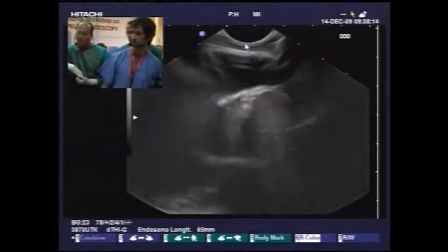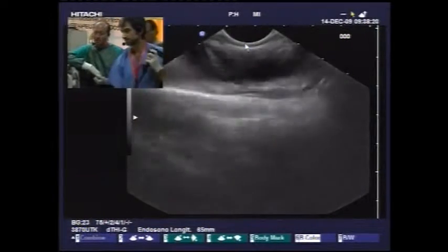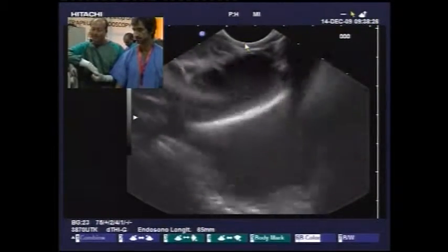With the pancreatic papillotomy? Even with the pancreatic papillotomy, it will get blocked because it's a very thick fluid here. It's not going to last very long. Drain, you'll be infusing the cyst with regular saline.